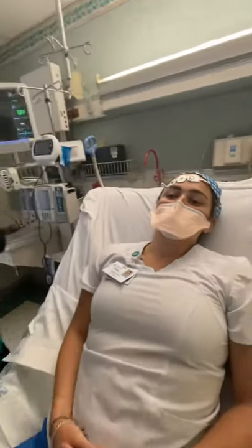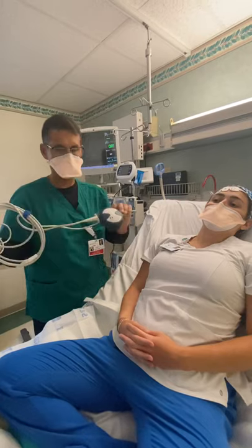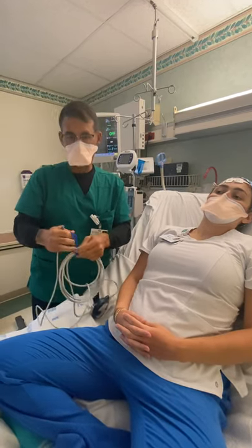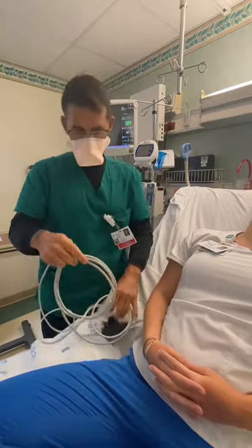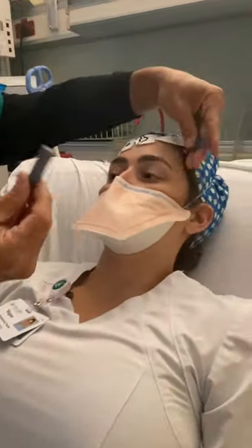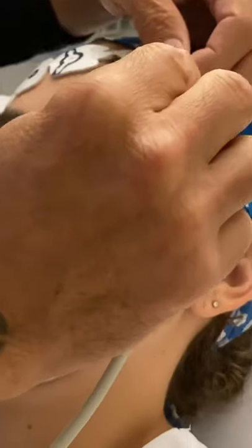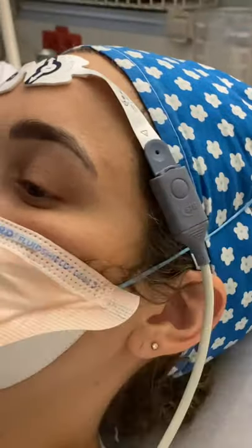Now you're going to connect the interface. This piece right here. You should not have these little gadgets, because I'm going to throw them all away, because they're an infection control problem. This piece connects to the leads, and it only goes one way. It has a certain shape, and it clicks in, and you're done.